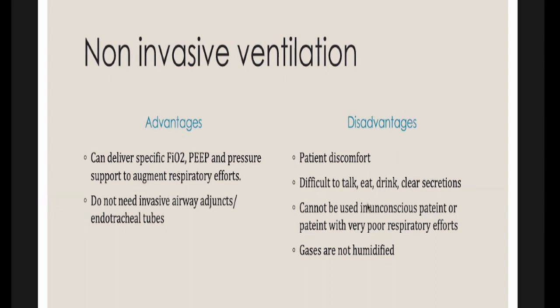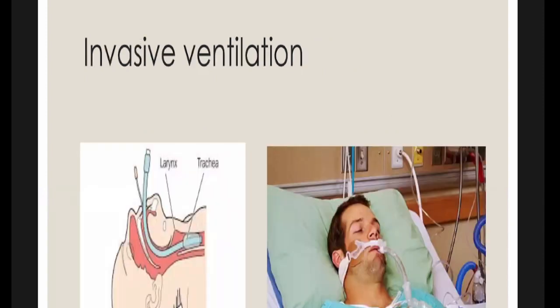And the disadvantage is the patient will have a little discomfort because they have this feeling of a massive gush of air coming and hitting their face, and it's very difficult to talk or eat, and they also can't drink and can't clear secretions. It cannot be used in unconscious patients or those who have very poor respiratory efforts. If their muscle power is very low, like in type 2 respiratory failures, it is not very effective. So the patient should be able to breathe on his own, and the gases are also not humidified. That is also a problem.